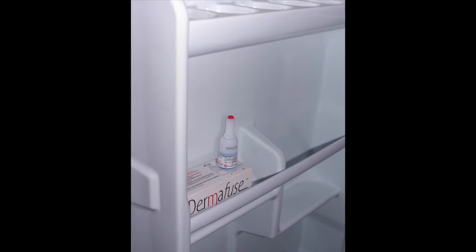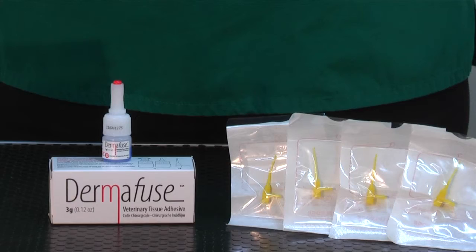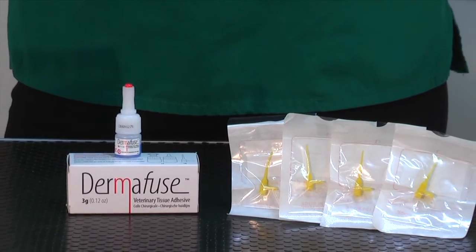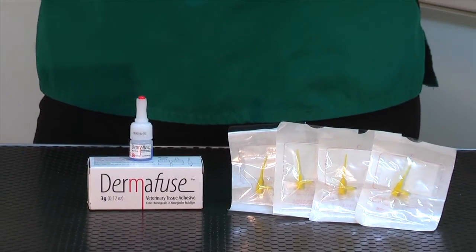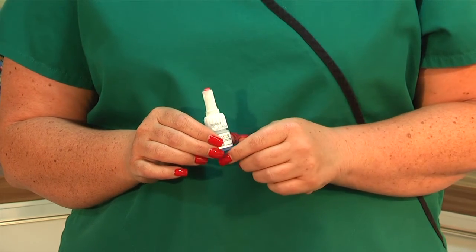If you store the Dermafuse in the fridge or freezer before opening, it will help maintain the life of the glue, or you can store the bottle upright in a cool dry place away from the heat. After opening, do not return the bottle to the fridge.